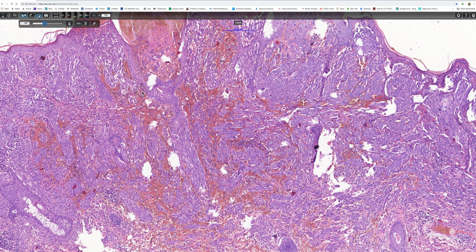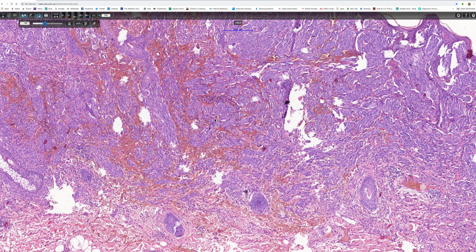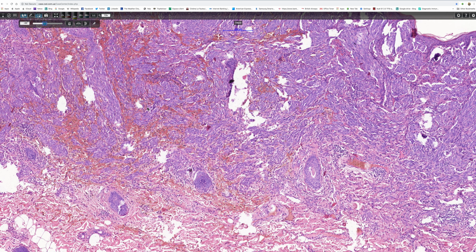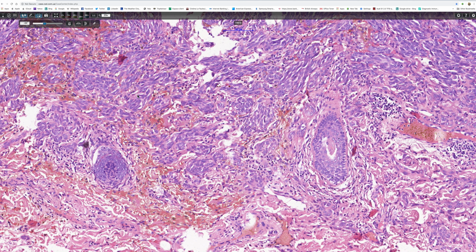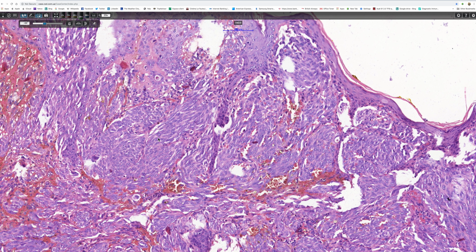And what you can do is work your way down and look at the left side and the right side with depth. So at equal levels in depth of the lesion, left and right should look the same, which I think they do. And as we go further down, the nest size on the left and the right is the same. And this field here shows us, yes, there is maturation, because we can see that the nest size gets smaller with depth. And I'm not sure about the cell size. We better go up to the top and have a look.